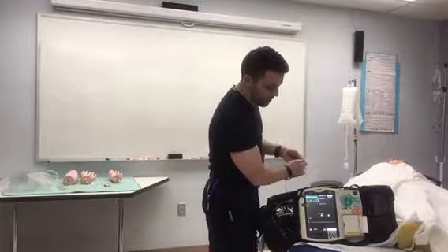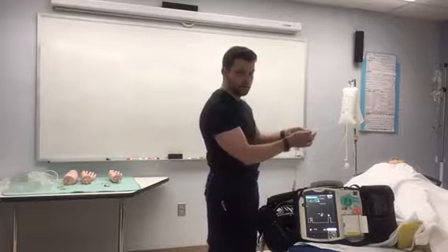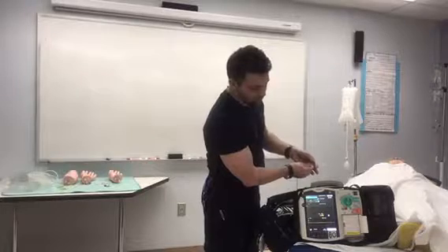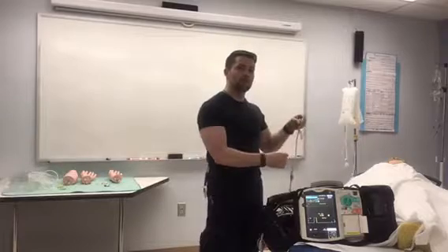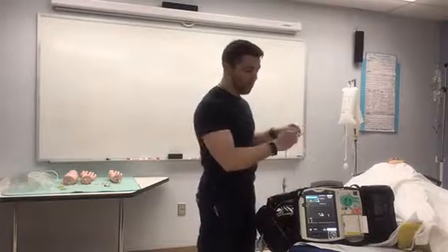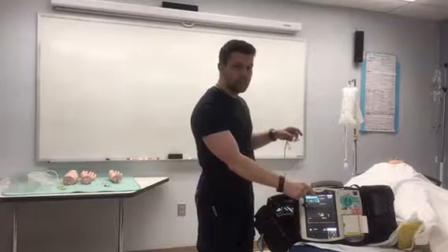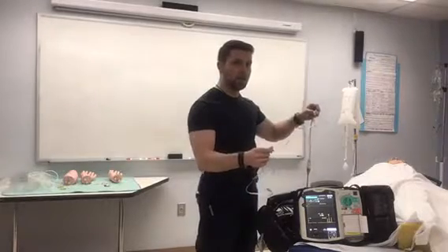So if we do the fast flush test, what we do is we pull the pigtail, and then we release the pigtail. Once we release the pigtail, you're going to see that it's going to notice the pressure change. So you see the waveform goes super high, square, and then it has a couple bounces. And what we want is about 3 nice tight bounces, and then go right back to baseline again. That's what we want. If it has a whole bunch of bounces across the line, like 7 to 10, that means that the line is too dynamic, and we're going to discuss why that is the case.